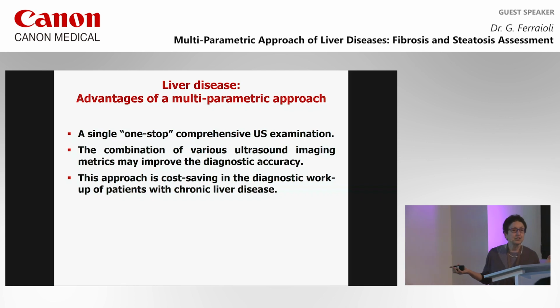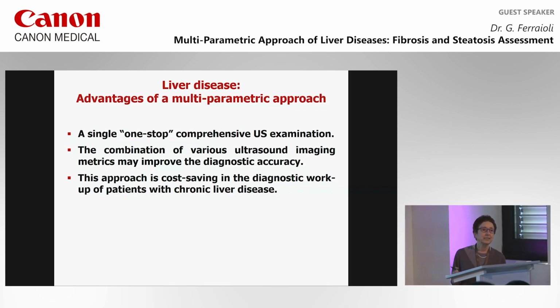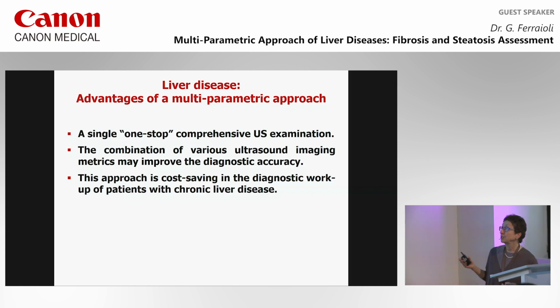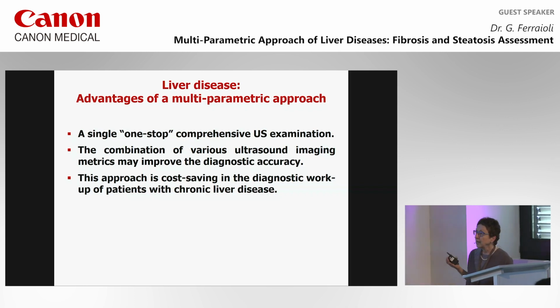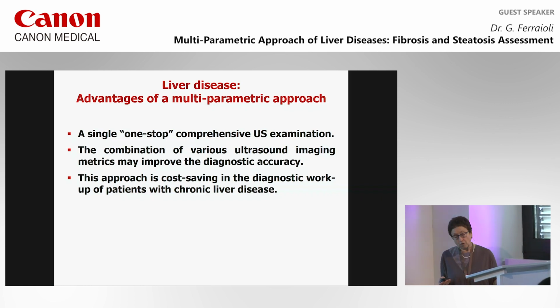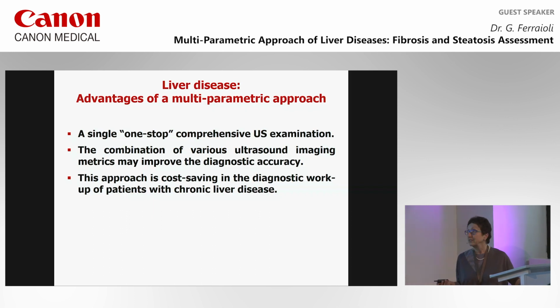So the advantage of a multi-parametric approach is a single one-stop comprehensive ultrasound examination. It is possible, combining various ultrasound imaging parameters, to improve the diagnostic accuracy, and this approach is cost-saving in the diagnostic workup of patients with chronic liver disease.